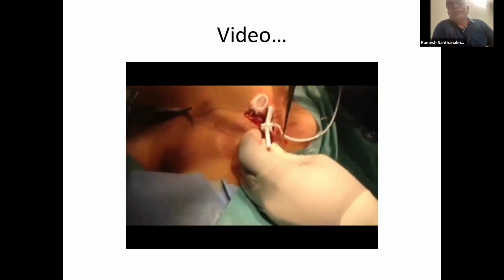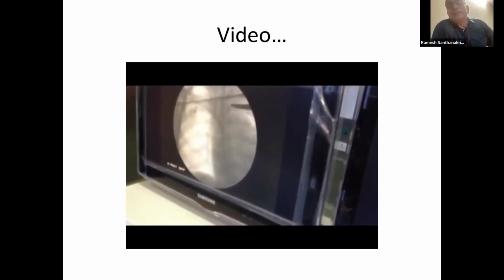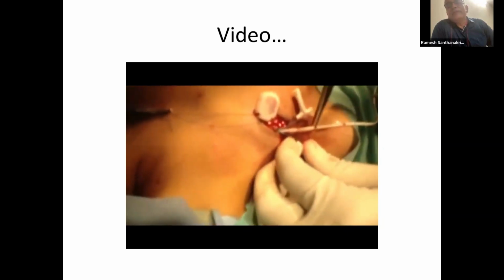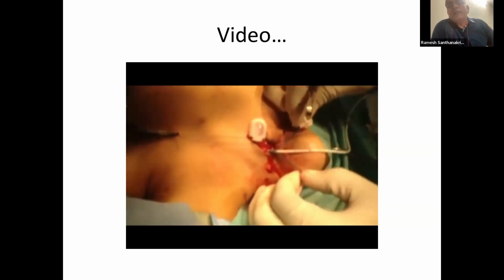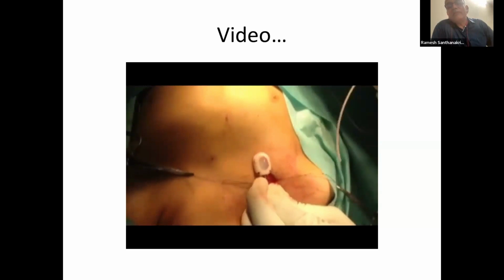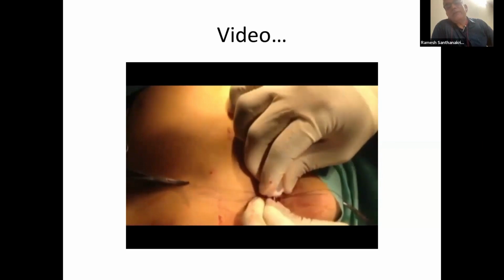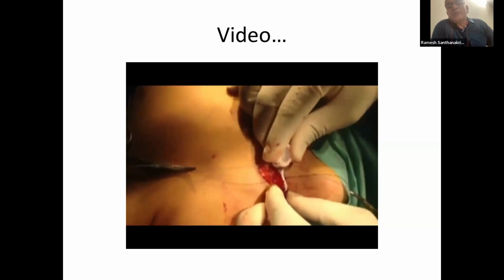This is how the port is being inserted now. If you can see, it's a peel-away sheath through which the catheter is being inserted into a predetermined space, confirmed by means of a C-arm to locate where exactly it is. The moment we know it is in the right place, we peel away the sheath and make sure that the catheter doesn't come out. The moment it is done, we trim it to the level that we prefer and we connect it to the port. Again, at every level, we make sure that the port is functioning: before connection, after connection, and during connection. We make sure that it functions well. So the catheter is being connected to the port.